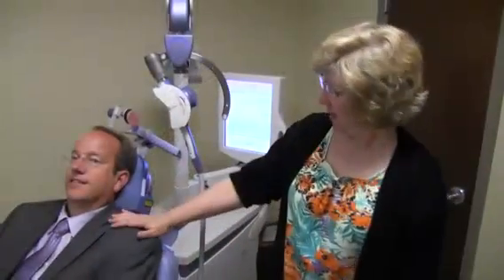The coil itself sits right on the head, and the magnetic field penetrates a little bit below the skull to an area that's called the prefrontal gyrus, and makes a change there, and there's a feedback loop between that and deeper down in the brain, the area that actually affects mood. So by treating with a small amount of magnet in a fairly superficial way, we actually get a deep change that goes all the way down to the brain, stimulates that part, and makes it start putting out the chemicals in the normal amounts. So our handy volunteer here has agreed to sit in the chair.